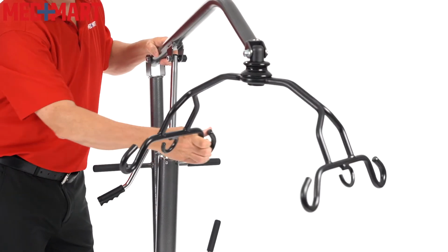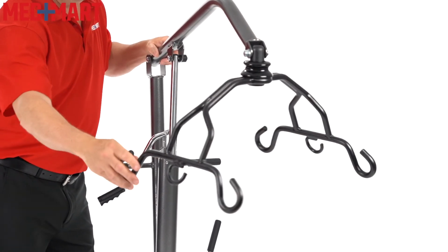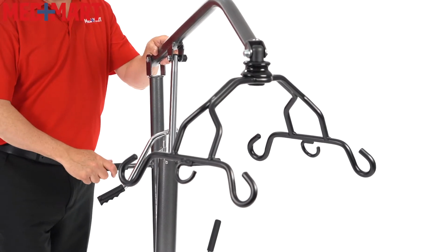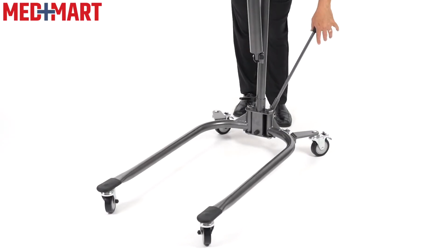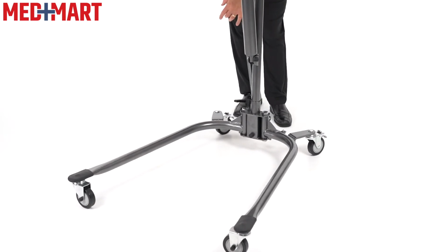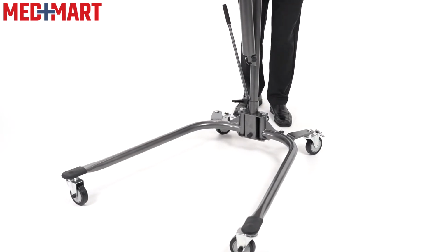The cradle swivels 360 degrees, so it allows you to do a lot of different kinds of transfers with this. It does feature an adjustable base, which using a lever allows me to widen up the arms for going around things like wheelchairs, around bedside commodes, toilets, things like that.